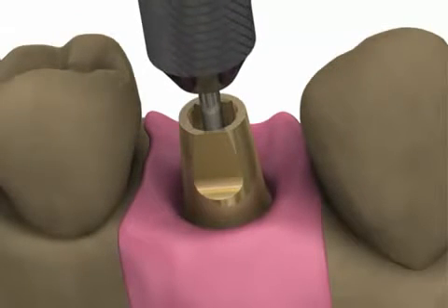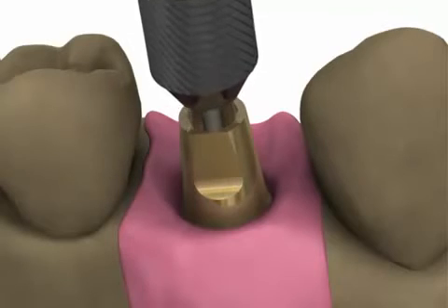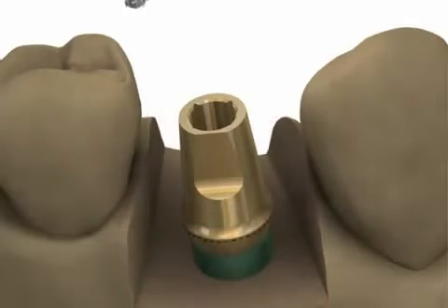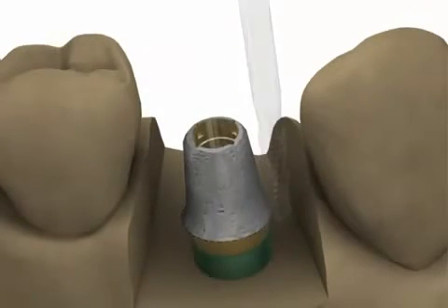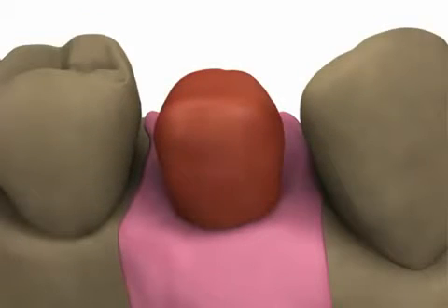The technician will seat the abutment on the model with the abutment screw and modify it as necessary for draw and angulation, and to refine margin heights. An anti-rotational feature will be maintained in single tooth cases. A custom prosthesis will then be fabricated using standard laboratory procedures.